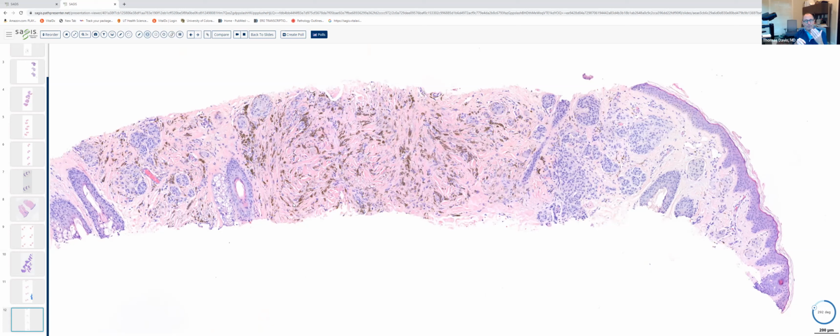We can get a blue nevus with a Spitz nevus. We can get balloon cell nevi. Those are combined nevi because you usually have a population of banal appearing melanocytes and balloon melanocytes. BAP1-inactivated melanocytic tumors are frequently combined nevi, commonly characterized by a banal nevus and a population of very epithelioid Spitz-like melanocytes.